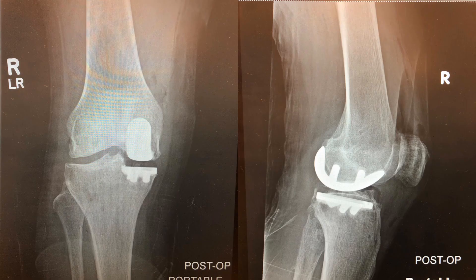Once the implants are in and the patient is closed, we'll then get a radiograph to confirm the appropriate position and alignment, and to confirm what we saw at the time of surgery as well as what we had planned for preoperatively. In this patient, you can see we have a tibia that is in neutral position. The femur is well-positioned and mated to the tibia. We can see the polyethylene insert in between, and we can also see the preserved lateral compartment as well as now a neutral mechanical alignment.